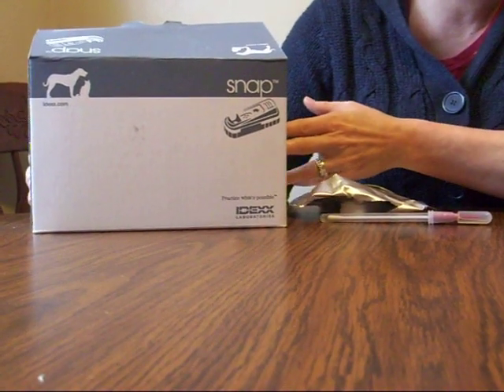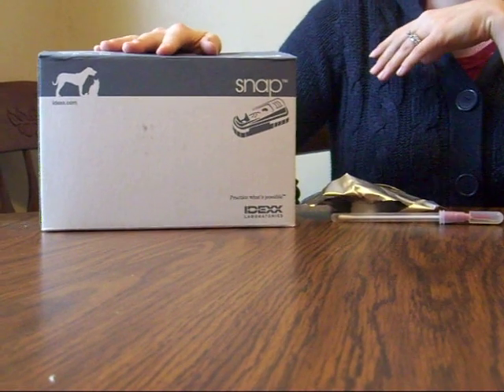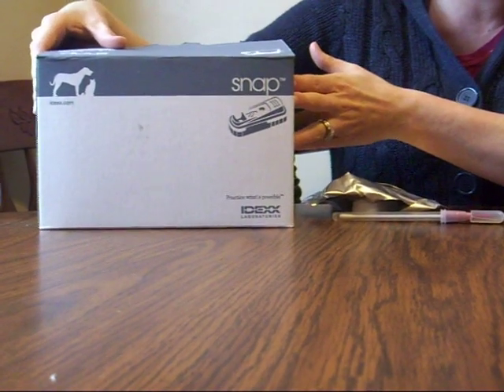I'm here to show you how to run a test for Giardia. These are the snap tests that I ordered from RevivalAnimal.com. This is what the box looks like when it comes to you.